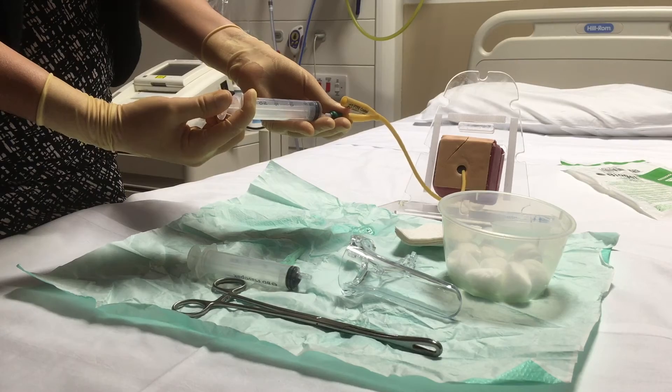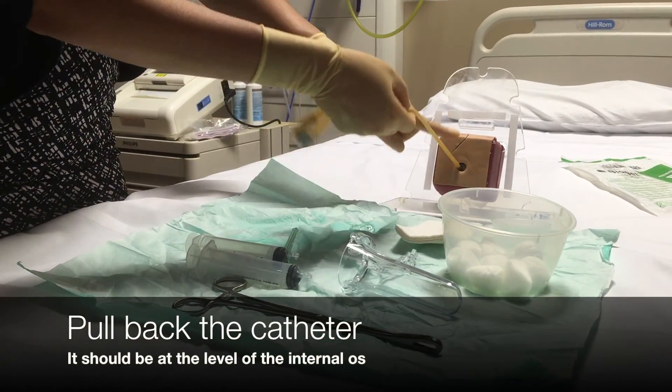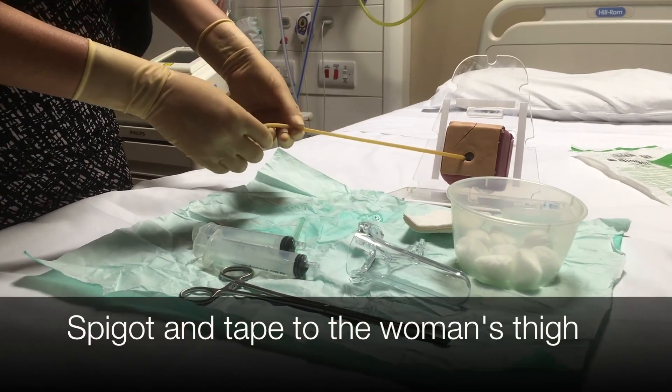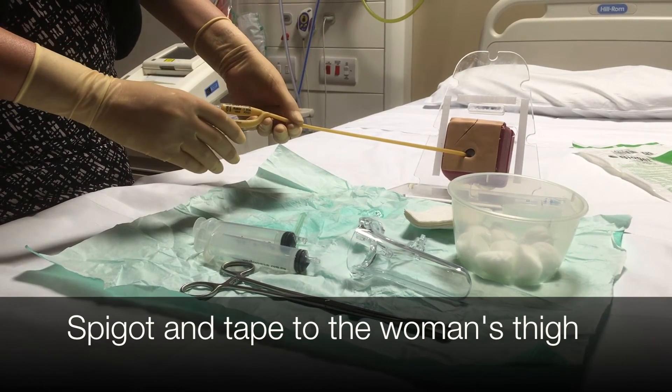Once your sterile water is in, you're going to want to give a firm but gentle tug to make sure that the catheter is indeed fixed inside the cervix, and then you're going to want to attach the rest of the catheter to the patient's inner thigh with some tape.